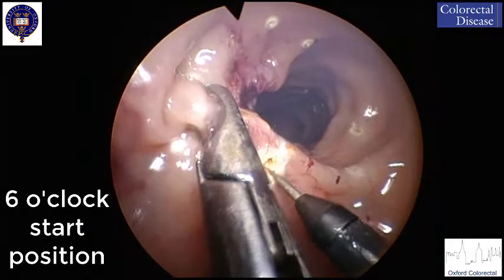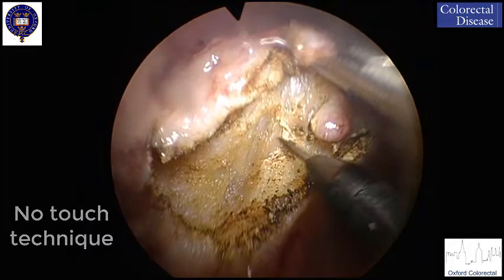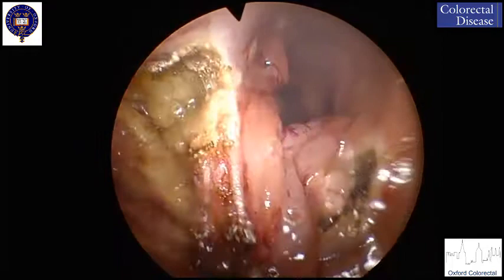Dissection with cautery was started from the lowest portion moving upwards to both left and right side through the rectal wall into the peri-rectal fatty tissue while making sure not to touch or disrupt the tumor. A full thickness resection is technically easier to perform than mucosectomy and is recommended for staging as well as to ensure adequate safety margins.